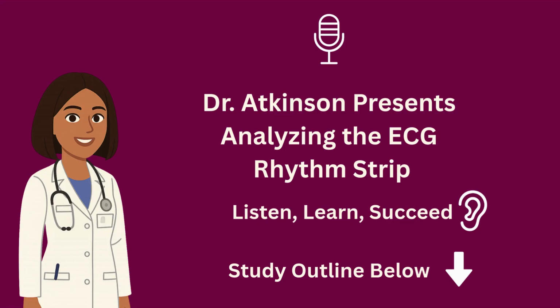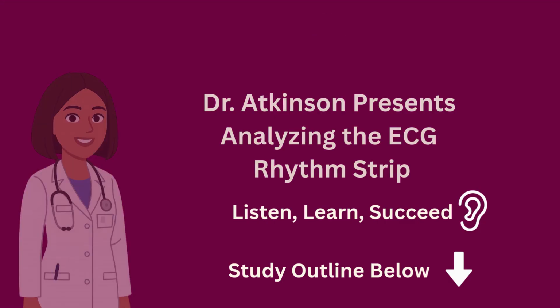In summary, analyzing an ECG rhythm strip is about methodical assessment. Calculate the rate, evaluate the rhythm, check each waveform, and always connect what you see on the strip with how the patient is doing. Technology supports us, but our clinical judgment makes the difference.